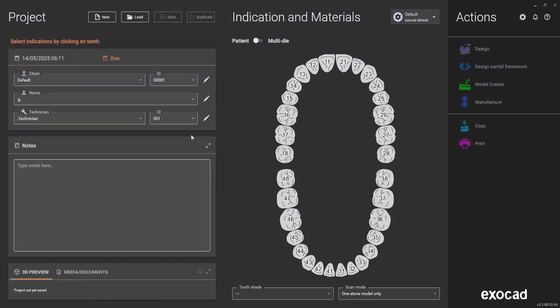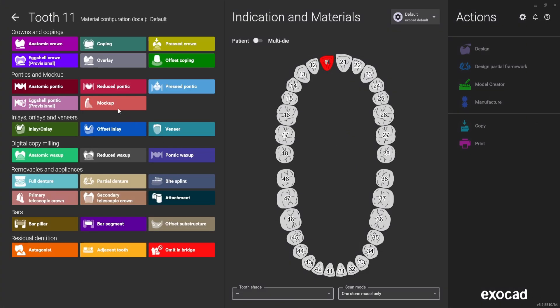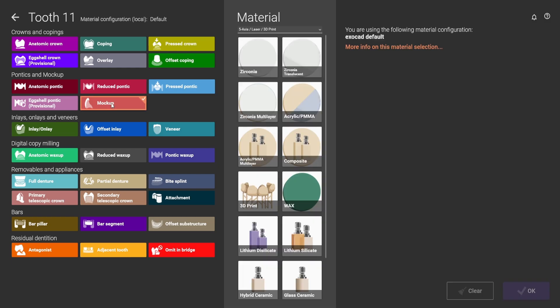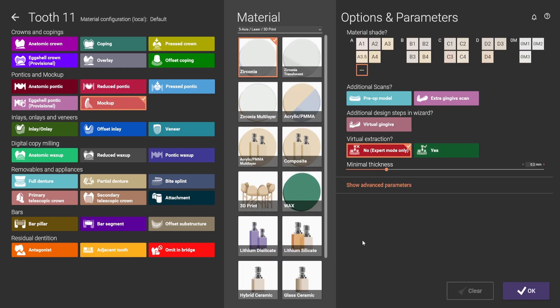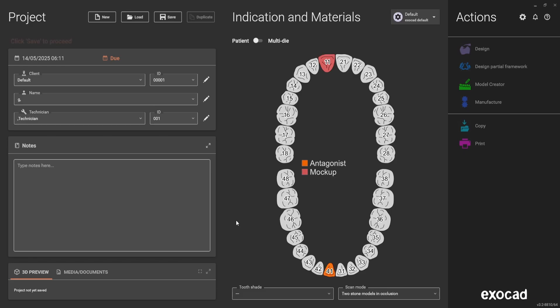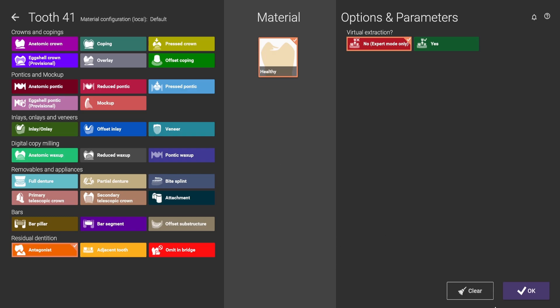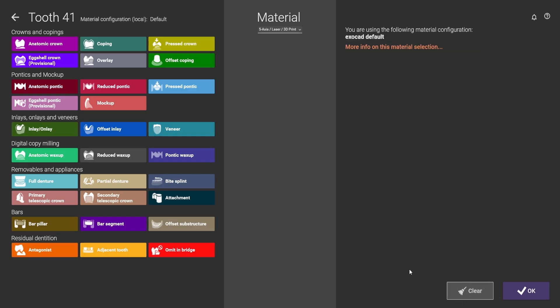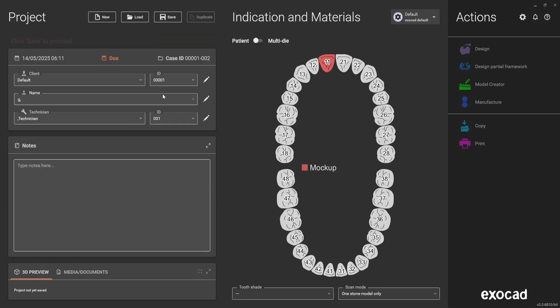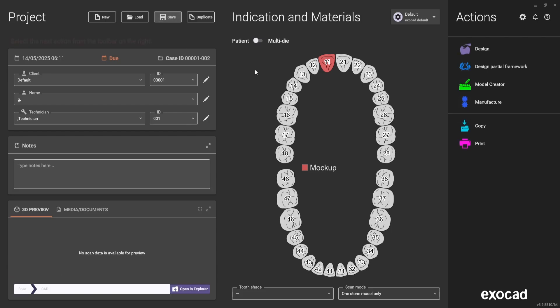So now that we have the full contour and the reduced file, we select Mockup. You can select anything and press OK. Save the project and we don't need antagonist so I'll clear the antagonist. Save and design.